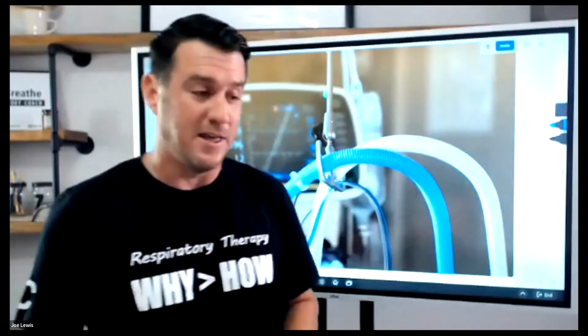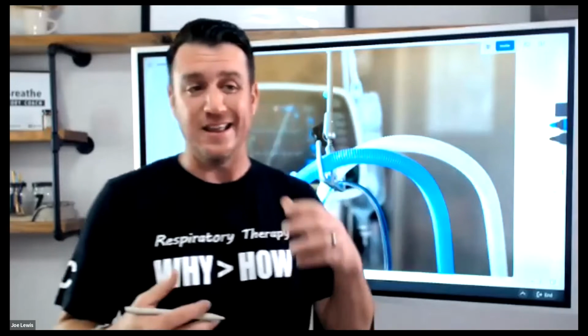And many years later, I've now come to recognize that that respiratory therapist was actually performing true ventilator assessments. They were not doing vent checks. And so the point here today in these 5 questions is to hopefully illustrate to you that every time you stand in front of a ventilator, there's a purpose for you being there.